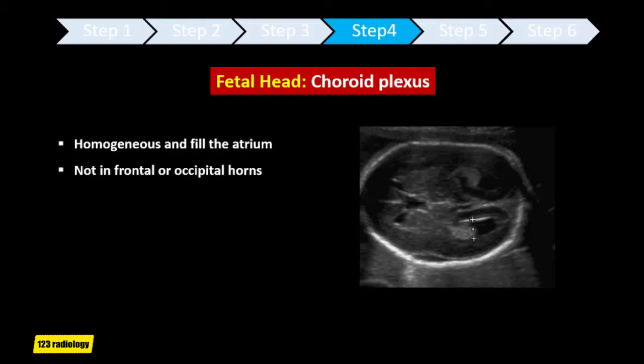Then look at the face. You should see two orbits, one nose and two nostrils, and examine the upper lip for cleft lip. Then go down to the neck — the guideline is to note only if there is a mass or not. Follow the spine from the head to the sacrum in at least two different planes. Look at the skin and vertebral ossification centers, check for any defect or mass, look for regular appearance of the bones for any deformation, and verify intact skin.